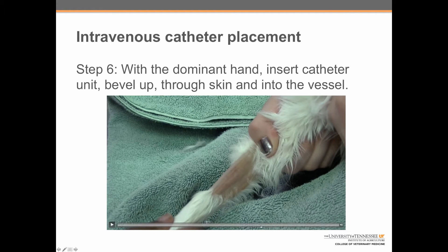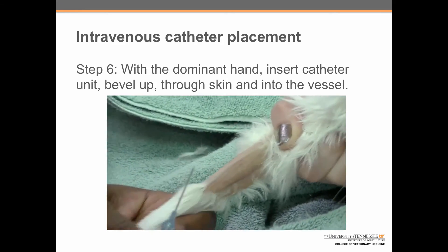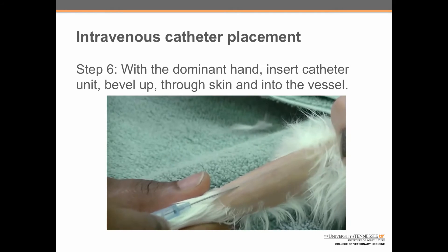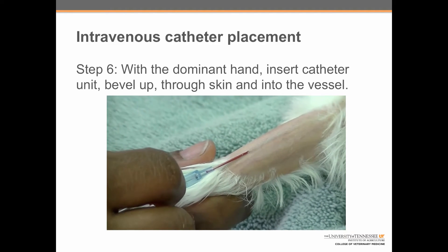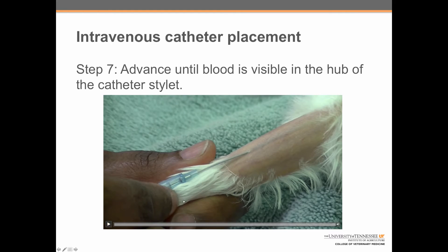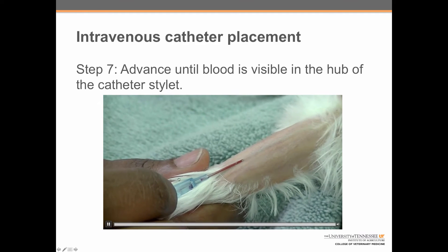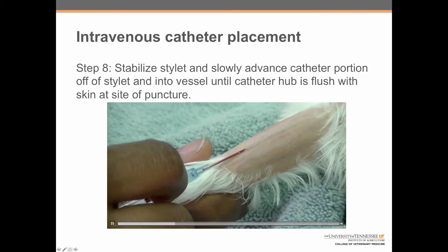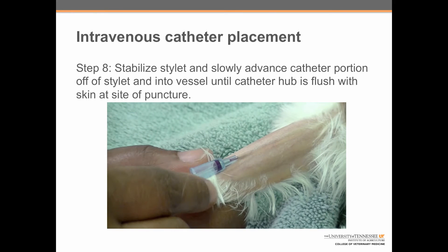Step 6: now from the other side of the cat, you can see the vessel clearly. With the dominant hand, she's going to insert the catheter unit bevel side up through the skin and into the vessel. She stabilizes the leg with her non-dominant hand, using her thumb to stabilize the vessel, and gently advances the catheter at about a 10-degree angle through the skin and into the vessel. Once she's done that, you can appreciate the flash of blood that came up the catheter very quickly, and she waits until that blood fills the hub of the catheter stylet.